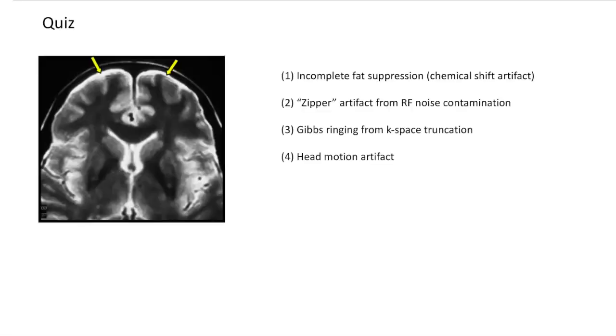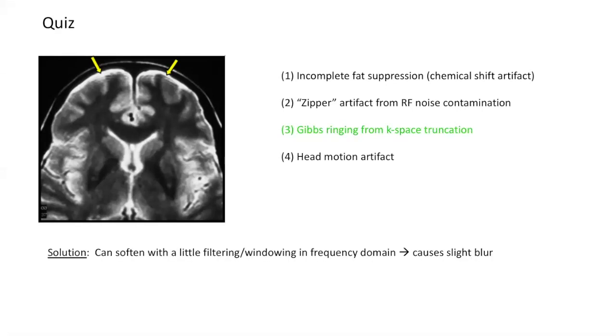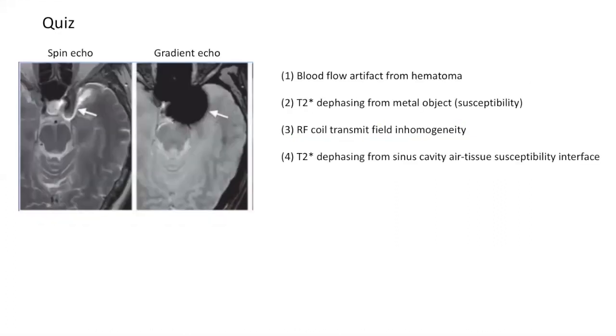I don't know if we still have time for the quiz. I could just go through. How about we pick like 2 of your favorites, then we just launch those. Yeah. All right. Well, trying to remember. This one wasn't my favorite. Okay. But yeah, this was just a Gibbs ringing, similar. We could do this one real quick.